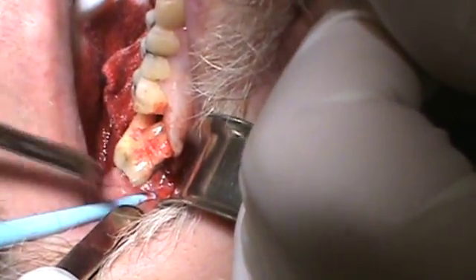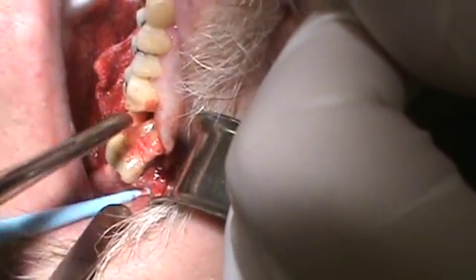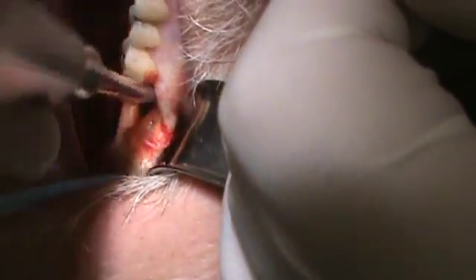Here we took out a maxillary molar, and you can see we've used the elevators in between the teeth. This thing just rolled on out — I already extracted it. Didn't even need to use a forcep, just had to use elevators.